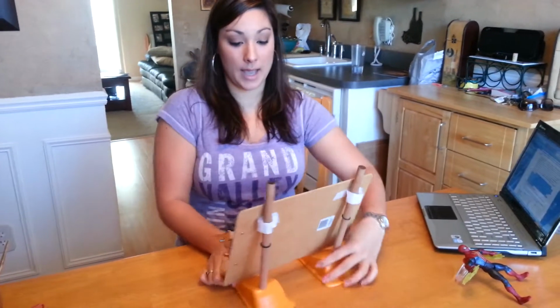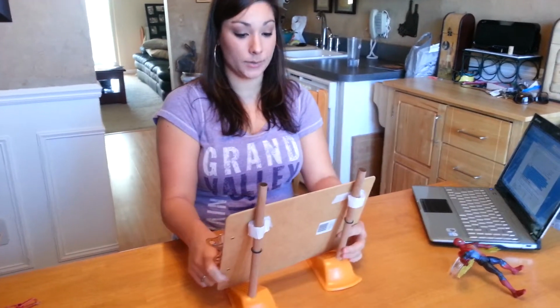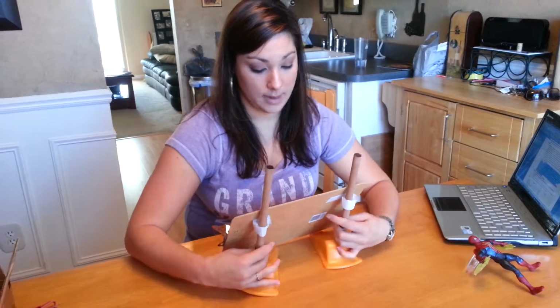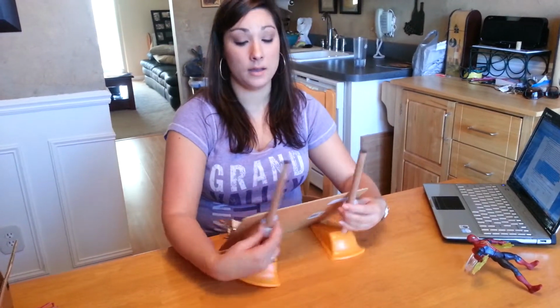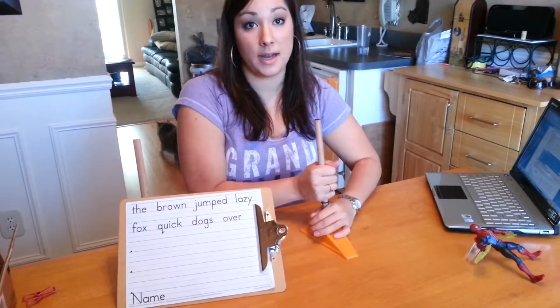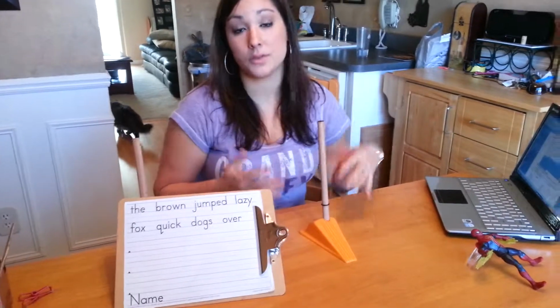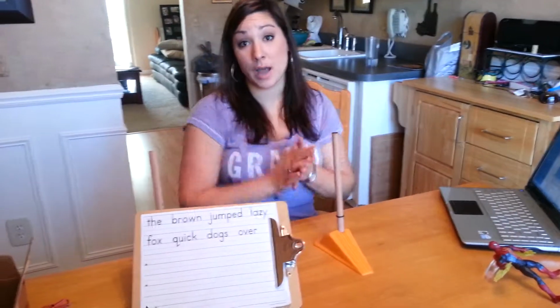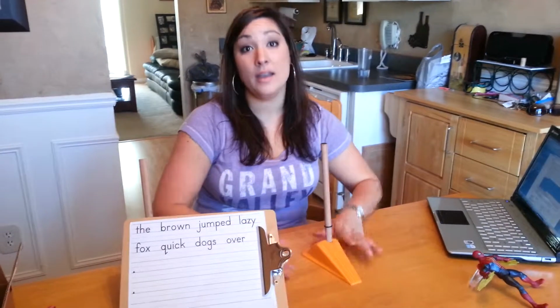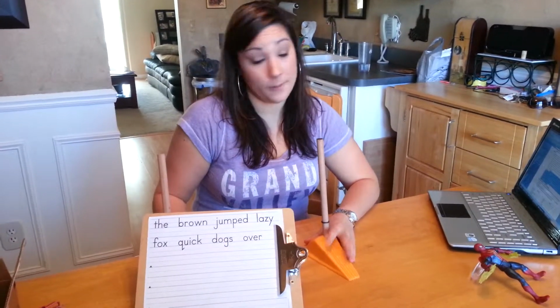It helps the child maintain the correct posture as they're reading it, and then you can always adjust it by pulling the O-rings down and adjusting the height. I also purchased suction cups that you can put on the bottom of this that will suction it onto the surface that you're working on, to the child's desk, to the lap. So a child with cerebral palsy might have a lap desk. It will suction to that, and then they won't move as much either.